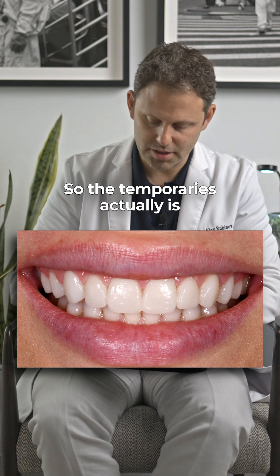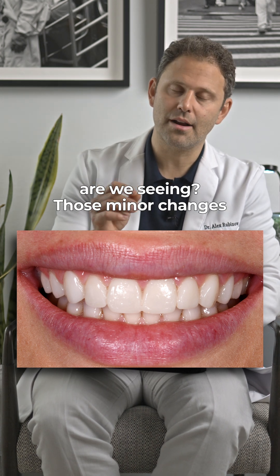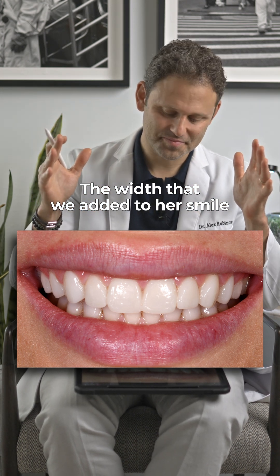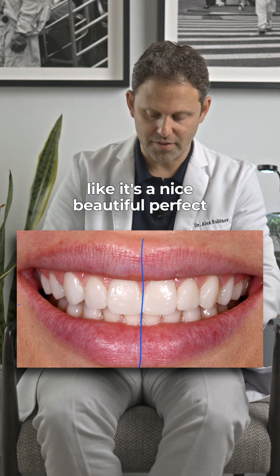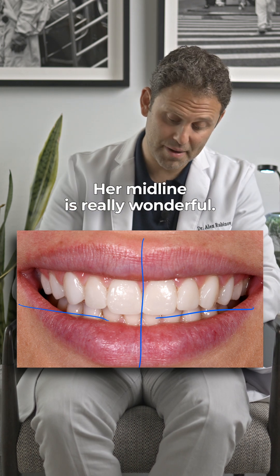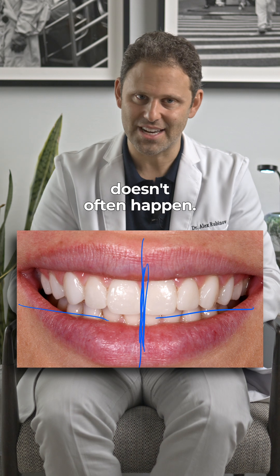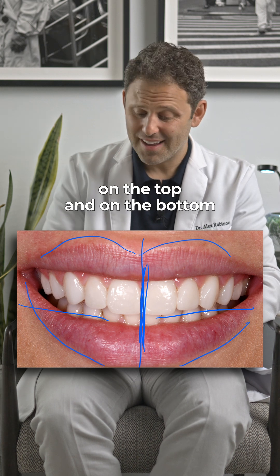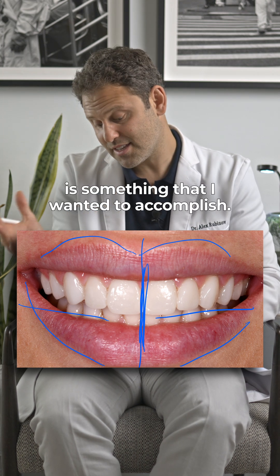The temporaries are actually going to be our final working smile. What are we seeing? Those minor changes that are majorly impactful — the width that we added to her smile, the length of the front teeth, the laterals, and the canines. It all of a sudden just looks like a nice, beautiful, perfect left and right, which actually doesn't often happen. But in her case, she has a lot of symmetry. Her midline is really wonderful — the ability to have the top and the bottom identical in line doesn't often happen, but it happens here. The way that her lips are on the left and right, on the top and on the bottom — a lot of symmetry. So creating left and right in her smile to be identical was something I wanted to accomplish.